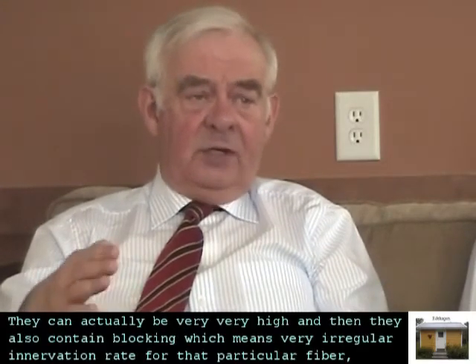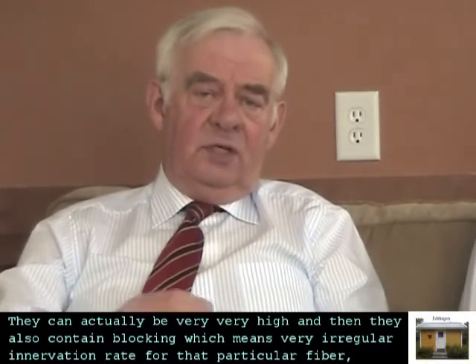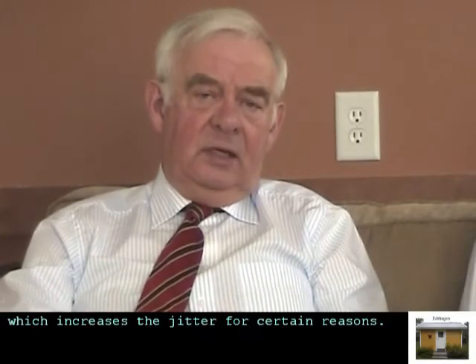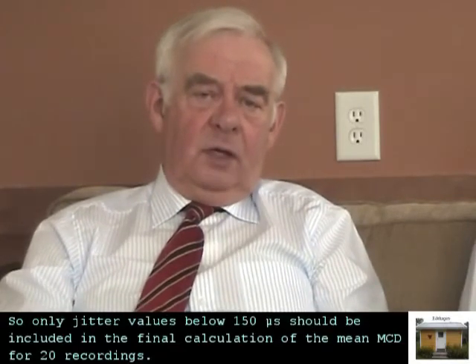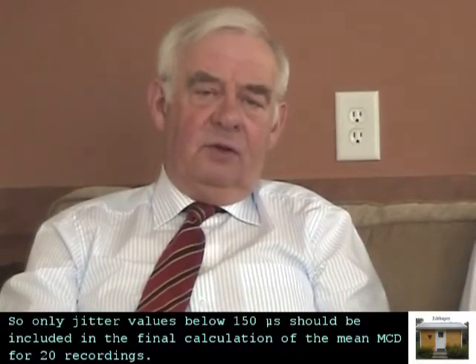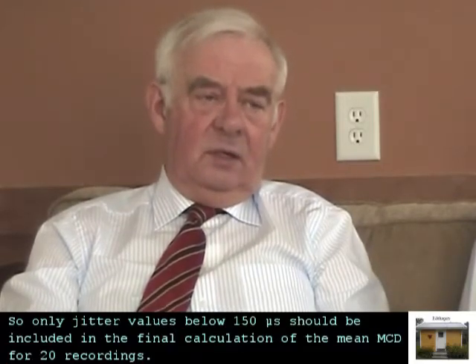They can actually be very, very high, and then they also contain blocking, which means a very irregular innervation rate for that particular fiber, which increases the jitter for certain reasons. So only jitter values below 150 should be included in the final calculation of the mean MCD for the 20 recordings.